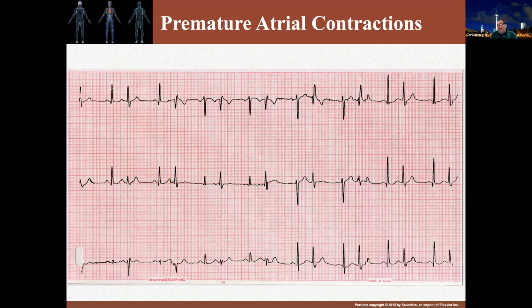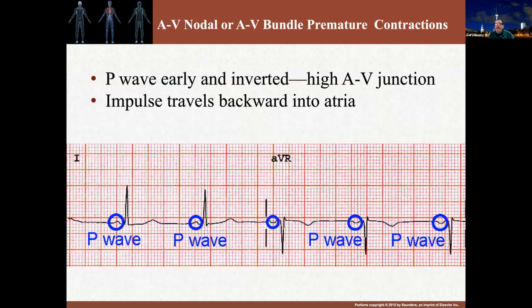And this is a regular EKG here of premature atrial contractions. It's not the best EKG for it, but certainly here and here you can see that it occurs. There also seems to be something funky going on here because you'll notice the variable profiles of the QRSs in this range here. Not quite sure what's going on there. But certainly in these first few beats here, everything is fairly normal. I suspect this individual has some underlying pathology.